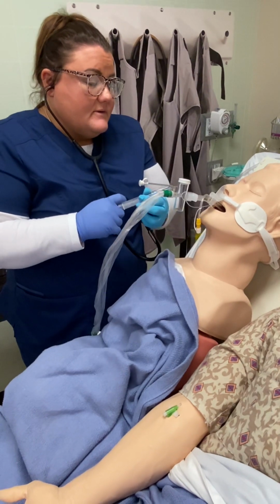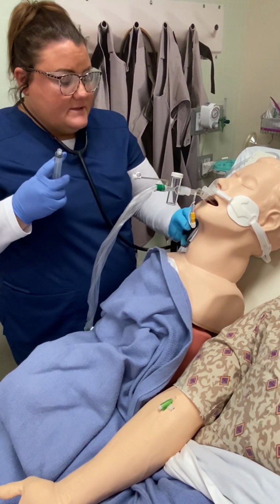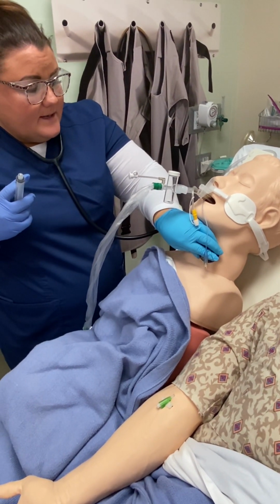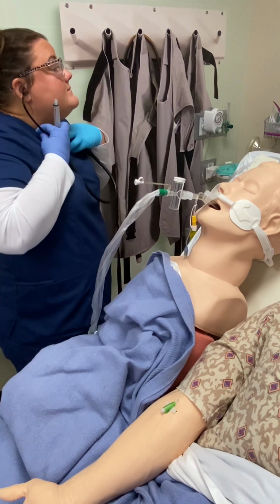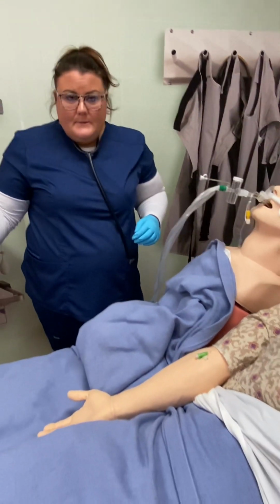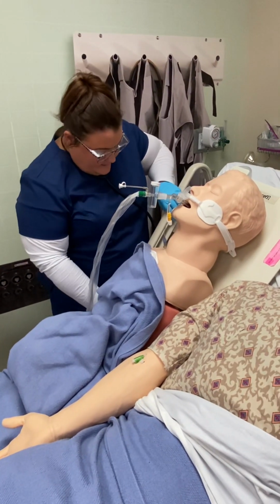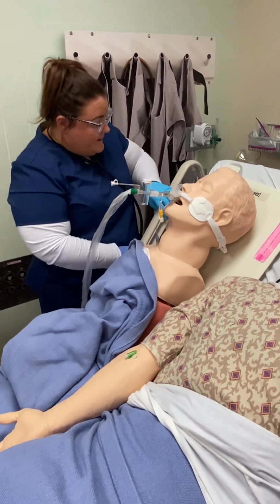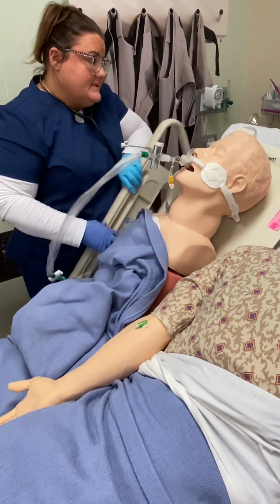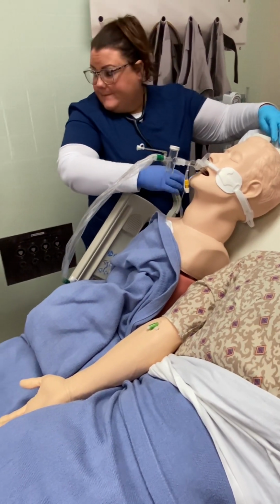Everything sounds good, so we're gonna go ahead and push this air back in. And just give a listen again to make sure we got all the air back in, and also look at my vent to make sure that there is no longer a leak. Okay, so everything is good there. Put this back up. All right, Mr. Smith, it looks like we are ready to get this tube out, so I'm just going to continue setting up some stuff and then we'll be ready to rock and roll.